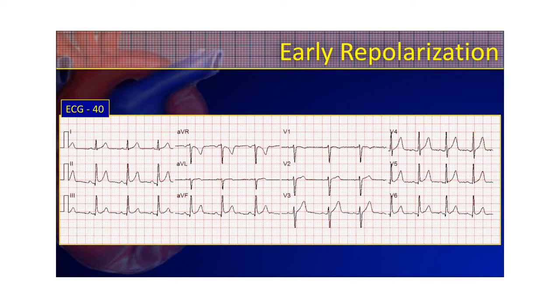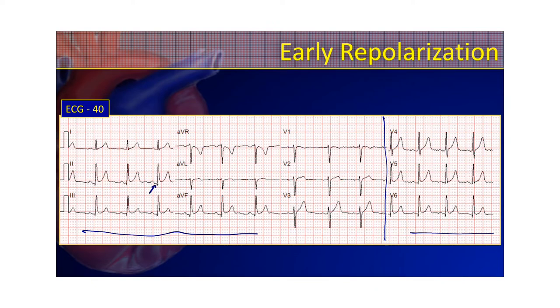Here's another good example of early repolarization. We have a sinus rhythm with a good normal axis and no aberrancy. We're looking for ST changes, and I do see a little bit of what you might think is ST elevation in these left precordial leads and maybe in these inferior leads as well. What makes it look more pronounced is the PR segment might actually be a little depressed here — you're seeing this trending down of the baseline and then going into that PR segment, which is also downwards. That's actually indicative of something called Spodick's sign, which is indicative of acute pericarditis.